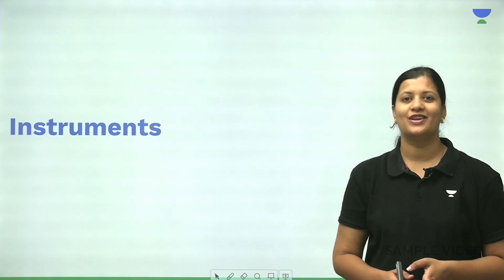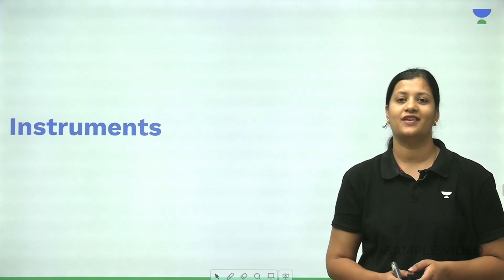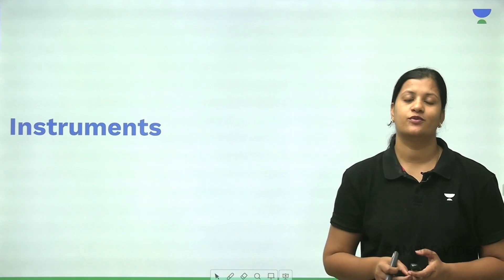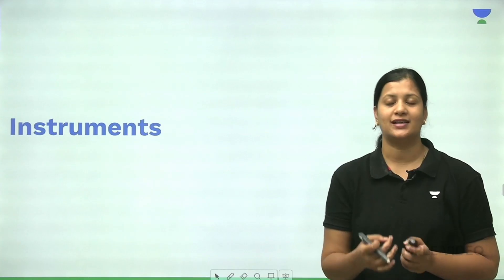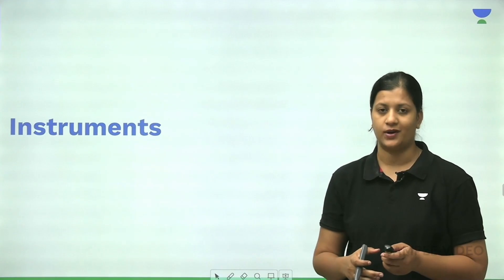Hello everyone, I am Dr. Vaishnavi, your ENT educator, and today we are here to discuss some common instruments that we use in ENT. It's very important to know the name of the instrument and some of the uses, as in examinations you might be given an image-based question where you might have to identify the name of this instrument.